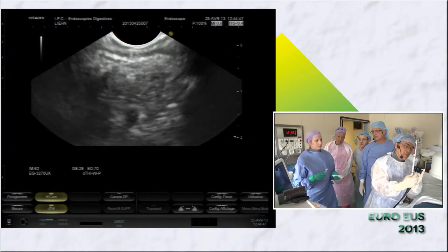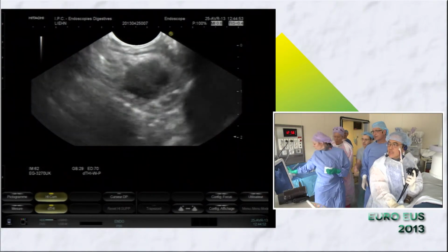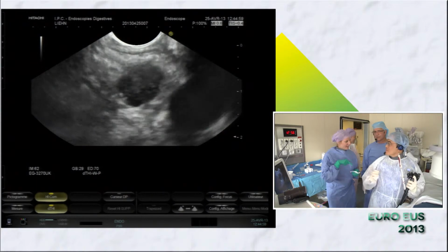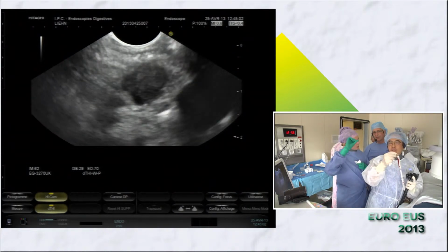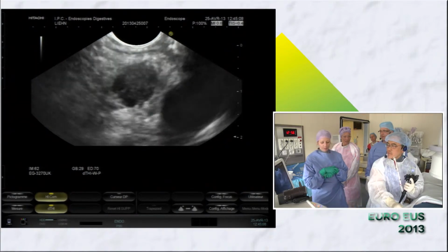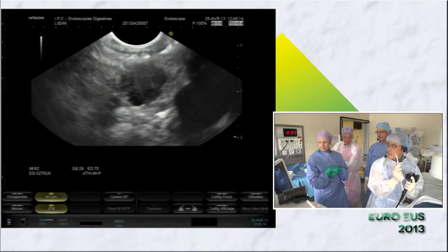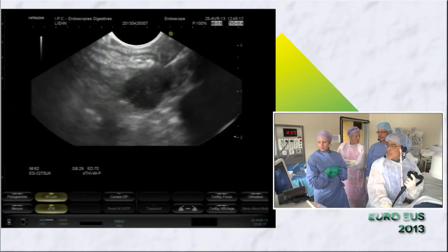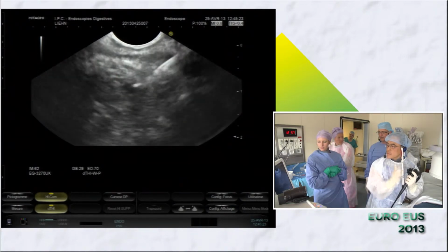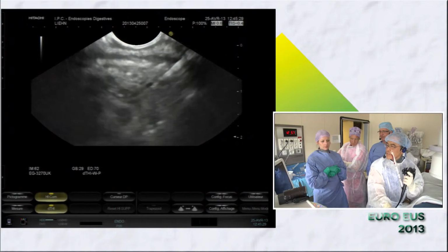I'm going to advance the sheath there. Slow pull, yeah. So I'll show you. Once I put the needle in, you just slowly pull, and then I go back and forth. Okay, not yet. So let me put the needle in first. So there's the needle. Let's make sure that we're in well.